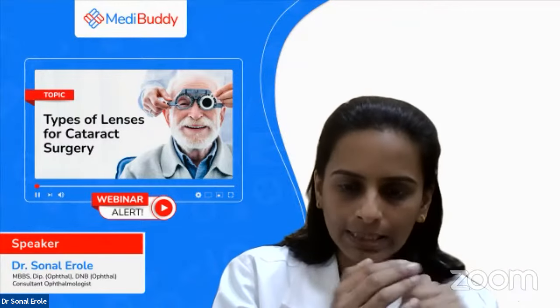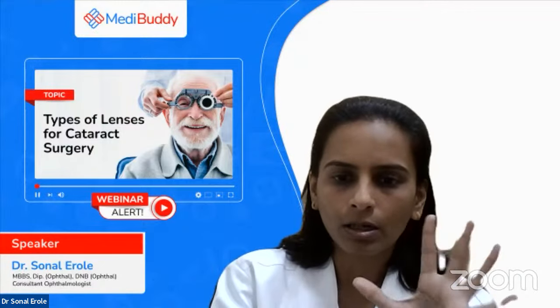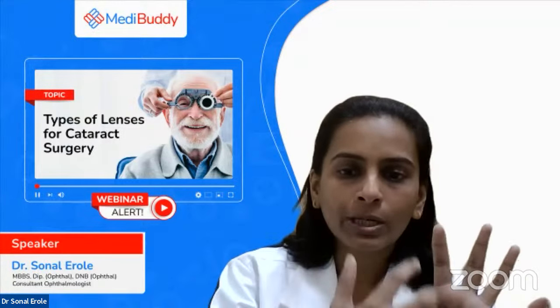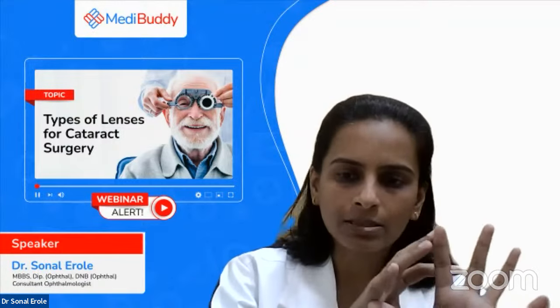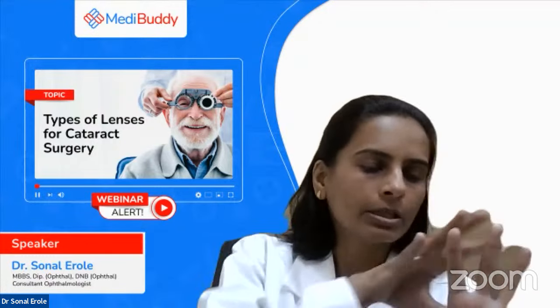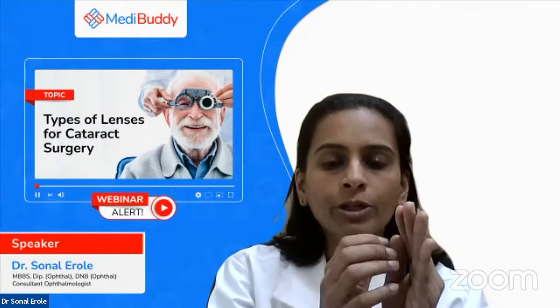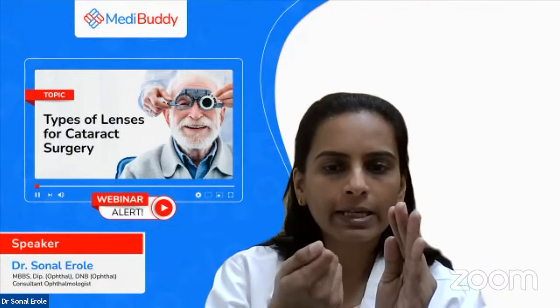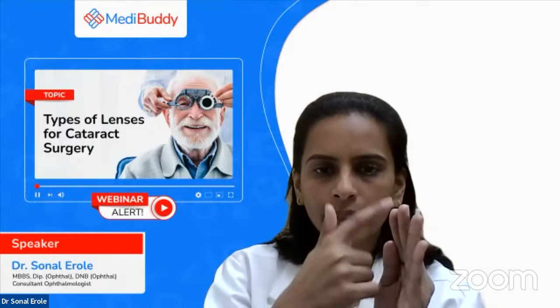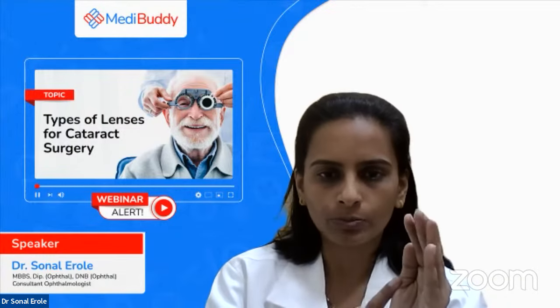Now, let us talk about some people who have a cataract, but the support of the natural lens is not good. Sometimes our lens is nicely supported in our eye, and what we do is remove the cataractous material from the bag and put the lens in this bag. If this bag support is not good, then we have different types of lenses for these patients.